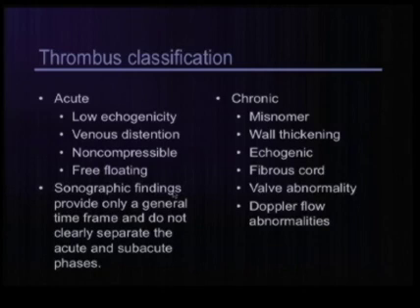And in the chronic setting, if the vein remains completely thrombosed or completely occluded and becomes a fibrous cord, one pitfall is to avoid mistaking a large collateral vessel for a native vein. Usually a collateral vessel will have an abnormal Doppler spectral pattern.